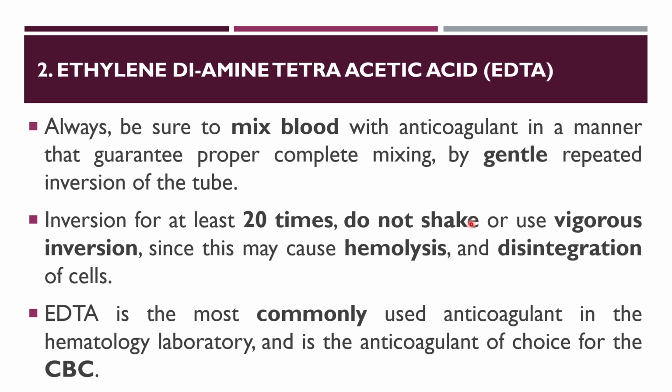You should not shake it very harshly because vigorous shaking may affect your blood integrity, such as it can hemolyze the blood, and then disintegration of the cells may happen. Also, EDTA is the most commonly used anticoagulant and the choice of anticoagulant for the CBC test.